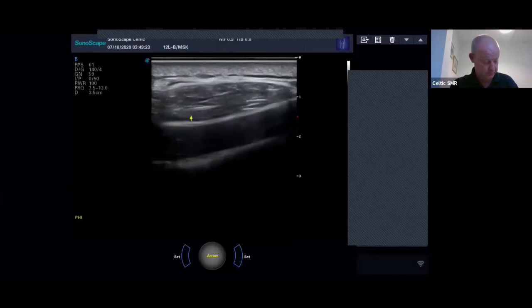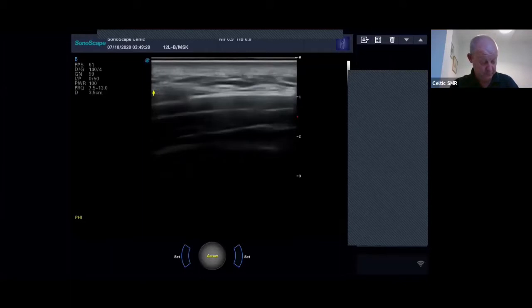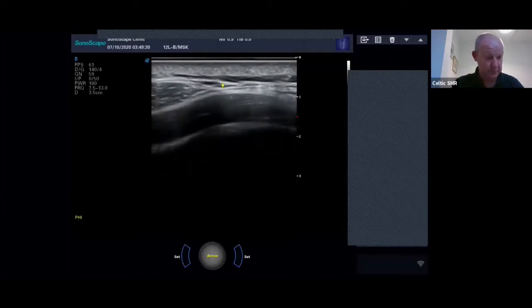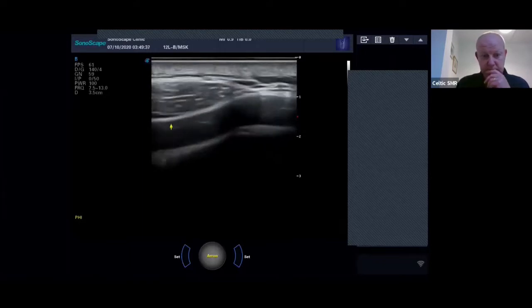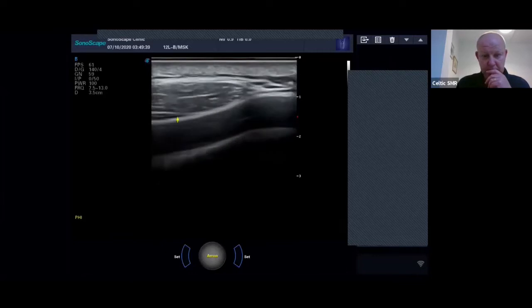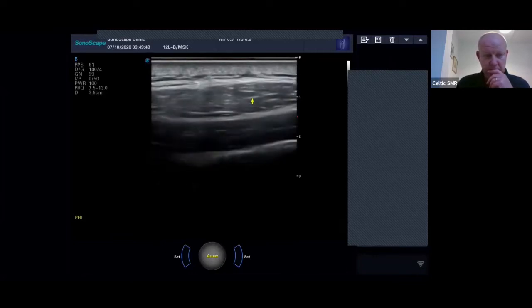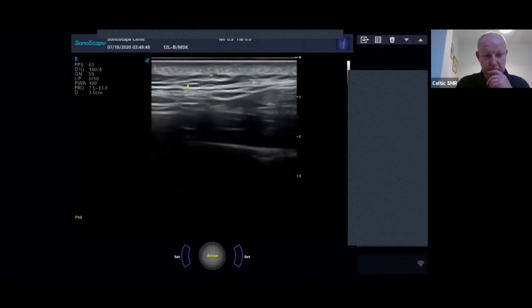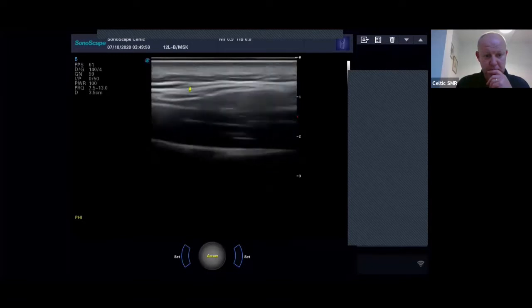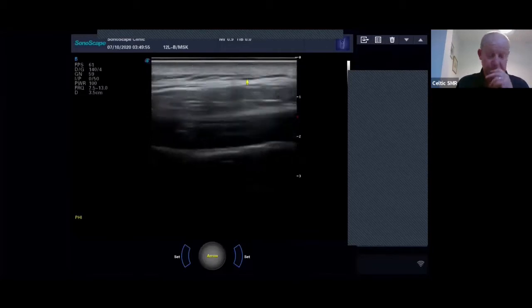So this here, all this is your lipoma. You can see there. This is the fat layer. So it's contained within the fat layer. So it's one thing we don't want to do is reach into the muscle layer. You can see it's nice and smooth. Okay. And then that's probably the end of it there, and then it goes back into normal fat appearance. So all this is that lipoma.